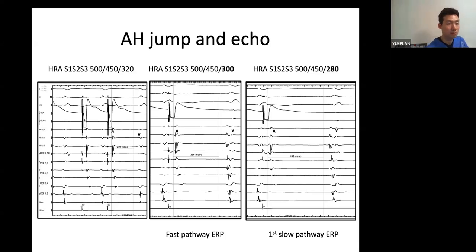You can vary earliest A exit from even the lateral wall of the mitral valve. Professor Jackman showed some cases, or in between, and only localized leftward extension involving only the left posterior septum. Okay? Honest with you, we do only maybe 1 to 2% of cases of typical AVNRT with a transseptal to ablate the leftward extension.